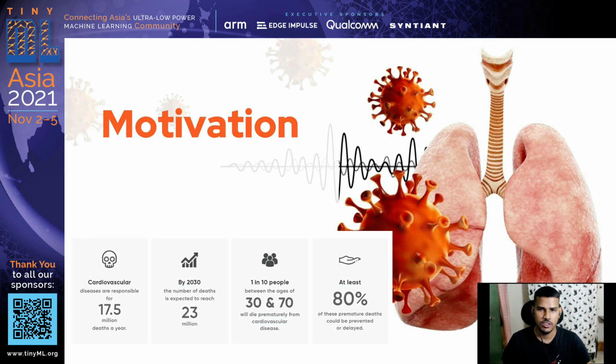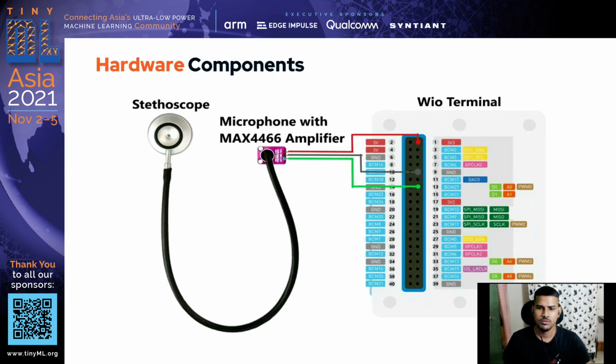What if we could avoid this step? What if the normal stethoscopes could reveal the abnormalities in the functionality of lungs by listening and analyzing the sound patterns, just like a doctor? With all these questions in my mind, I developed a proof of concept to detect the symptoms of COVID-19 and wheezing at the edge.